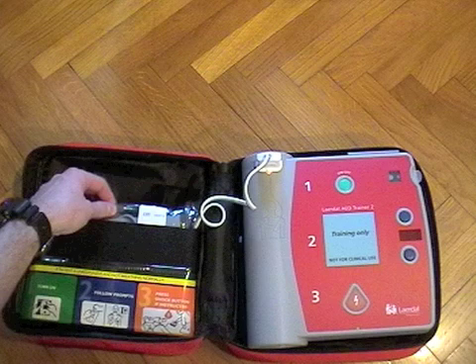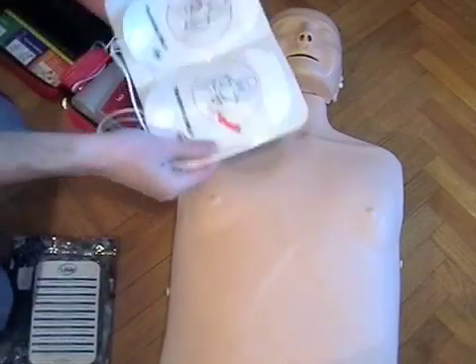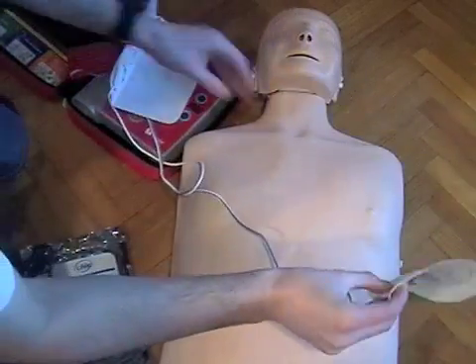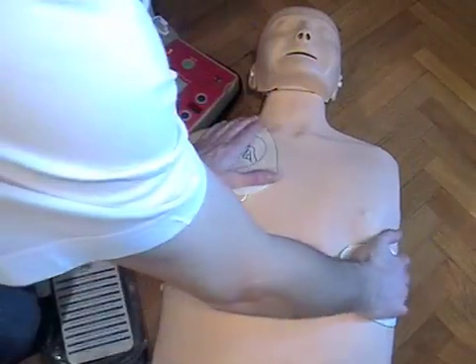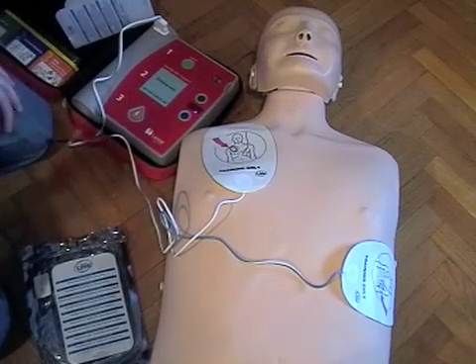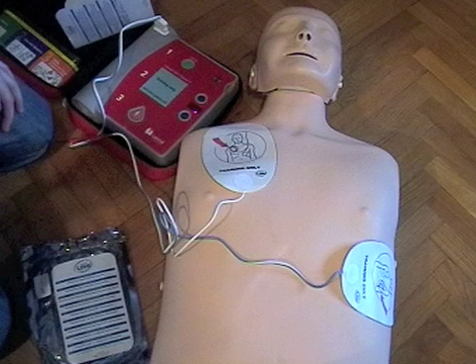Its first instruction was to apply pads to the patient's bare chest. Applying pads to the patient's bare chest is rather simple. Each manufacturer has very simple and straightforward diagrams which depict where to put the electrodes on the chest. Once pads have been applied, the AED automatically starts recording and analyzing the patient's heart rhythm. It is important not to touch the patient at this point because this could interfere with heart rhythm analysis.